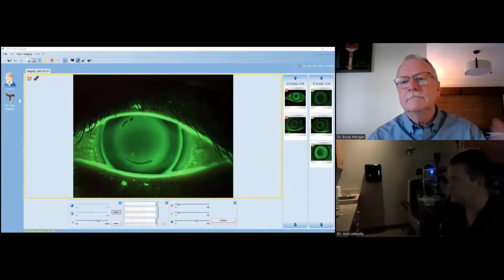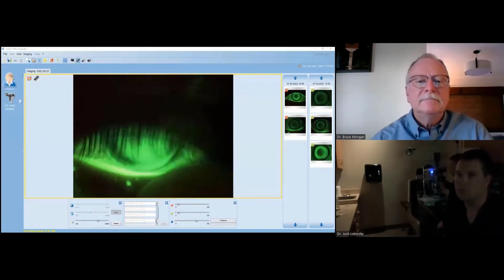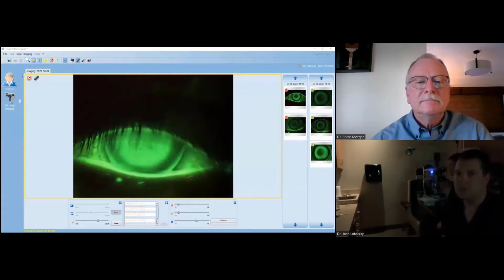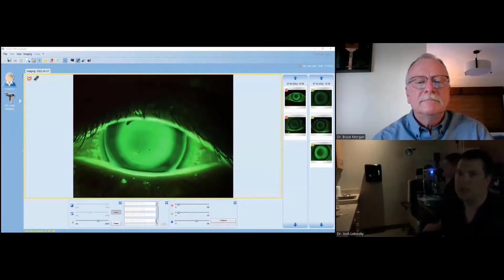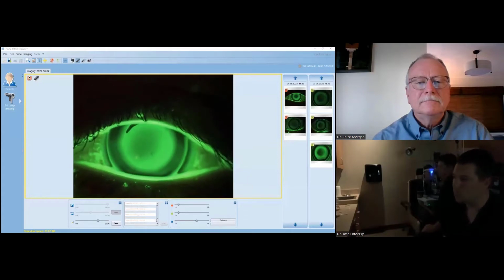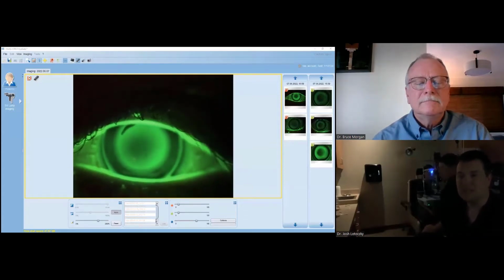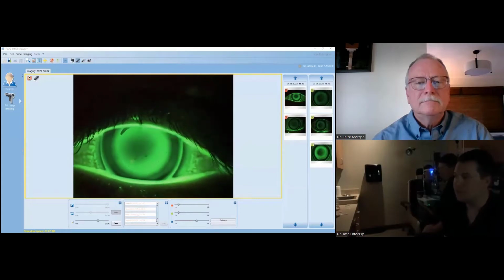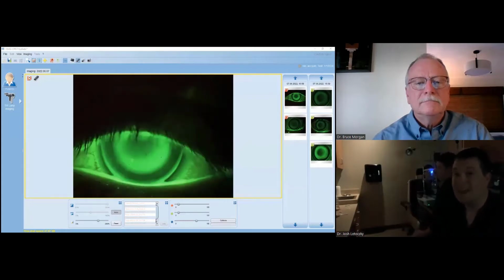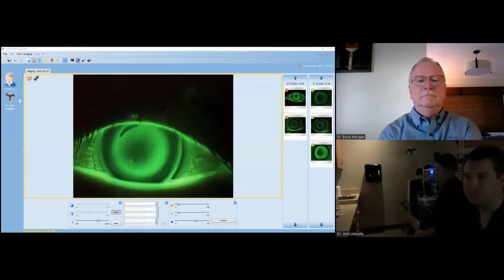Because we really do like to see the lenses on eye that first morning, to try to visualize everything about it. Is the lens stuck? Where is it sitting? What does the eye look like? Is it happy, unhappy? All of those things are really helpful because it helps us evaluate the health of the eye and how it made it through the night too.